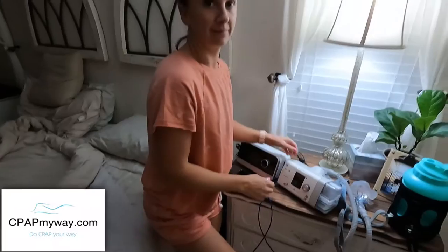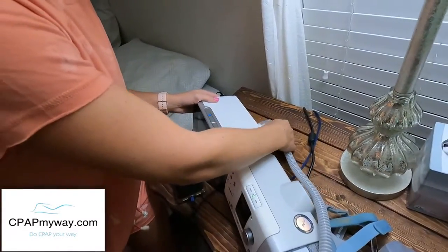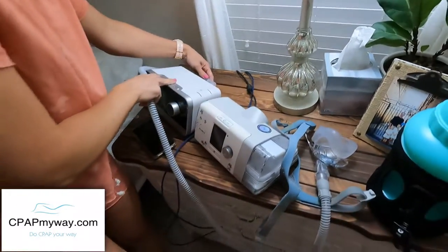Wish us both luck, because a mama with very little sleep is not good for the family, so nobody wins. We'll see. All right, so here we go. Let's get her hooked up. I'm just going to go straight from one CPAP to the next. Same mask, same setup.